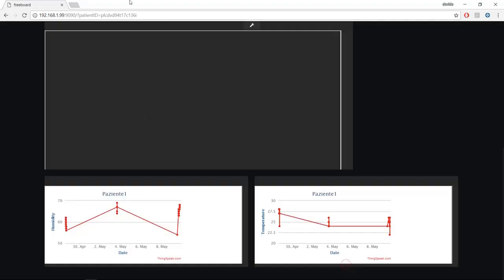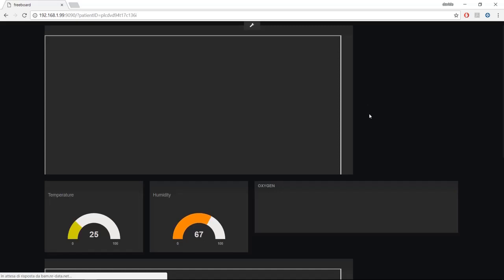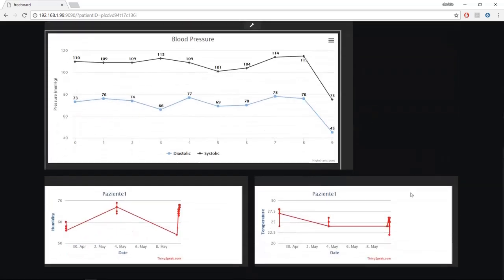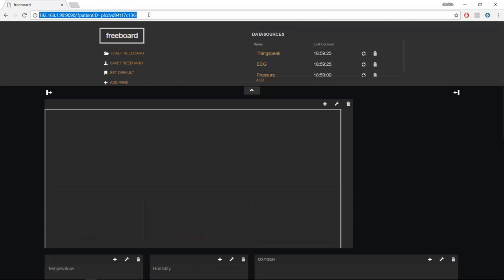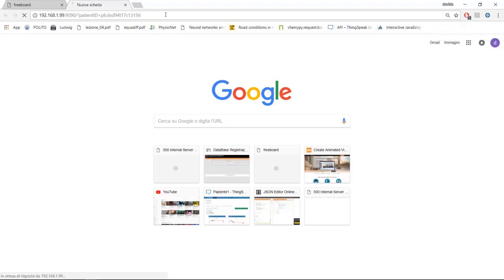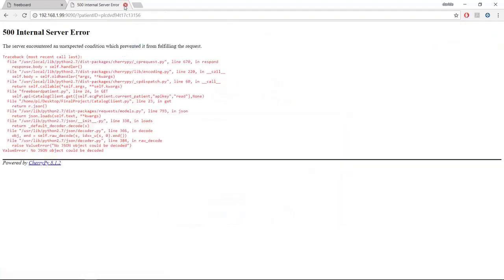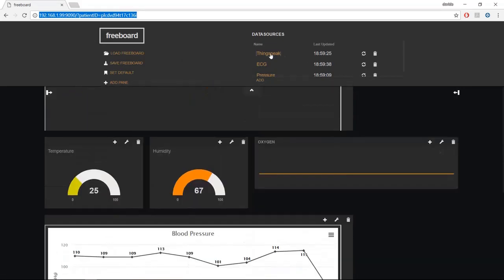In fact, if we go here and run the Freeboard dashboard, we can see all the panes related to the resources of this specific patient. We can see in fact that if we try to get the information of a patient who does not exist, Freeboard will return an error. Here we can see that there are 3 data sources: ThingSpeak, ECG and pressure.